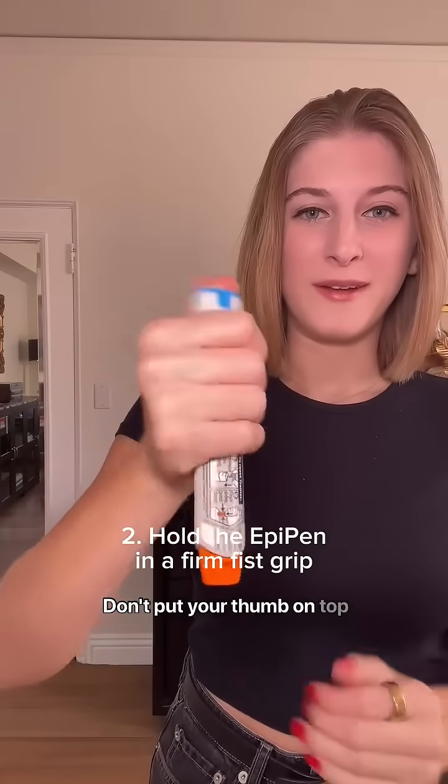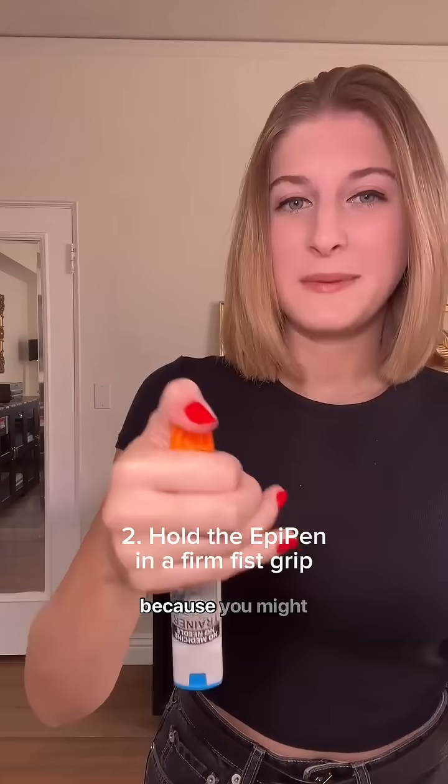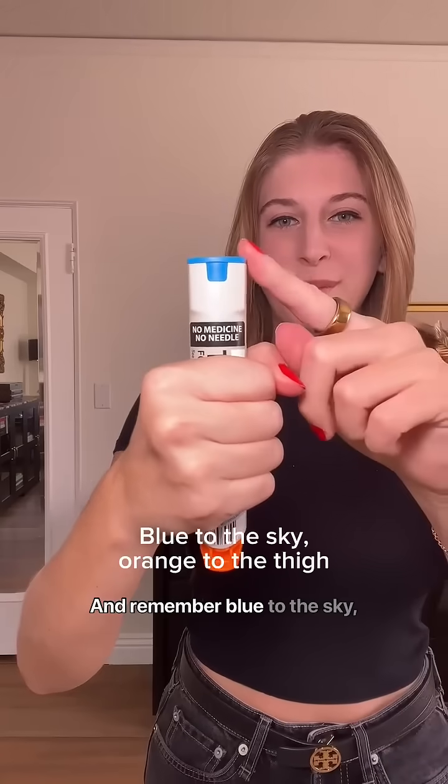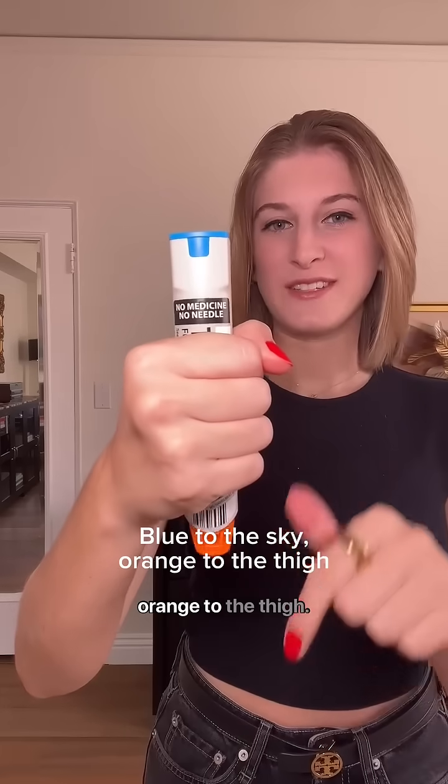Hold the EpiPen. Don't put your thumb on top or your thumb on this side because you might accidentally stick your hand — a family friend of mine did this. And remember: blue to the sky, orange to the thigh.